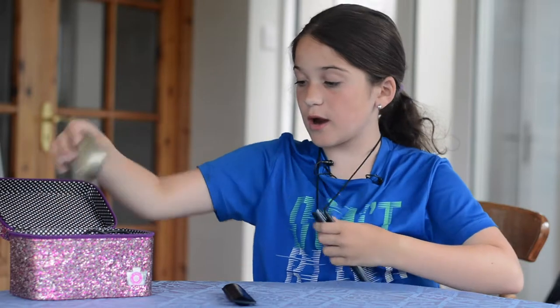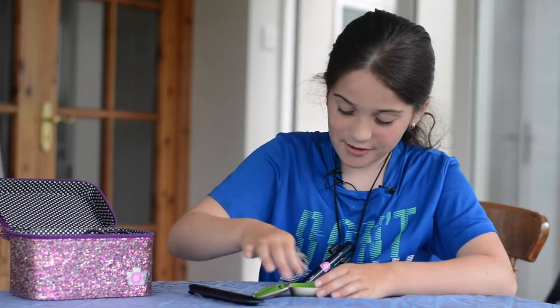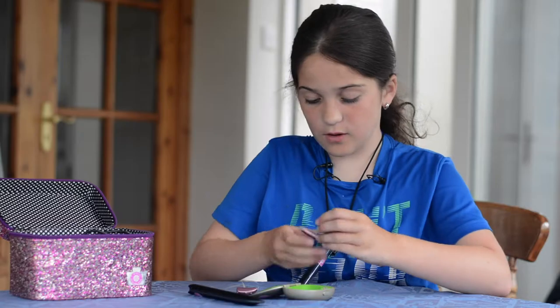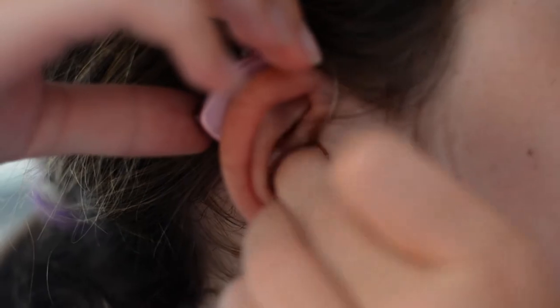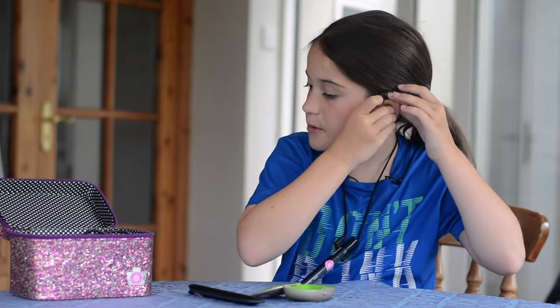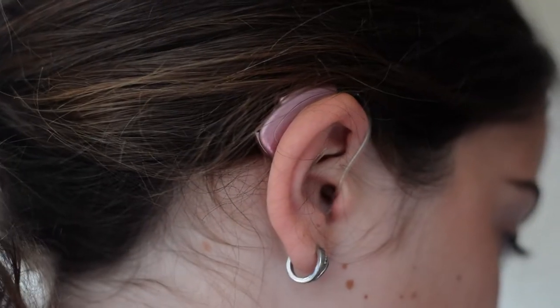And then what I wear — for me to hear her — is these. One goes in my right ear. It has little red circles. The one with the red is right, so I put it in my right ear. Then I put the left one in my left ear — I know that because there's a little blue circle.